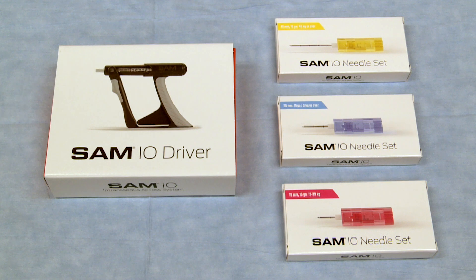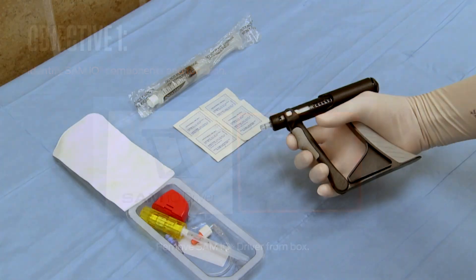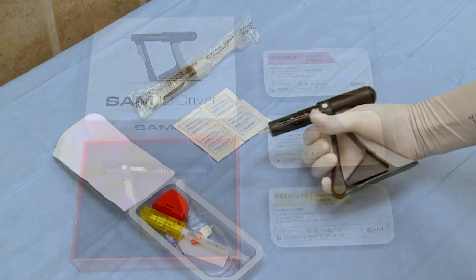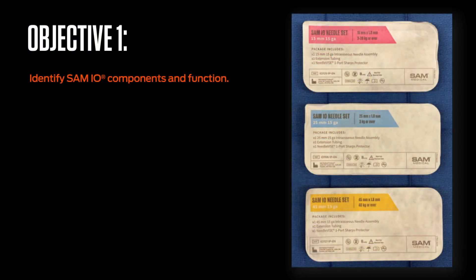The SAM-IO driver, which is reusable, can initially be found in its supplied packaging. Remove the driver from its packaging and repeatedly compress the driver's assembly to appreciate its unique function. SAM-IO needle assemblies are provided sterile in color-coded, size-specific, labeled packaging. Standard sizes include a pink 15-millimeter 15-gauge needle assembly, a blue 25-millimeter 15-gauge needle assembly, and a yellow 45-millimeter 15-gauge needle assembly.